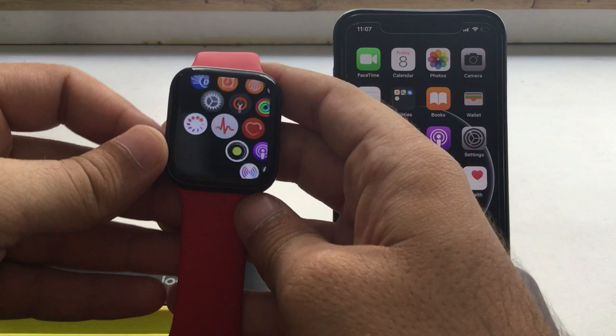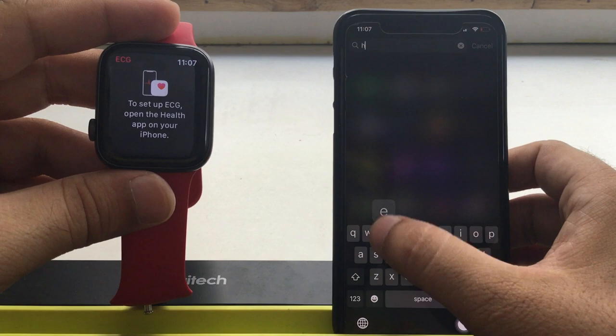Press the digital crown button to move to your Apple Watch app screen, find the ECG app and tap on it. Now setup will start from iPhone's health app.